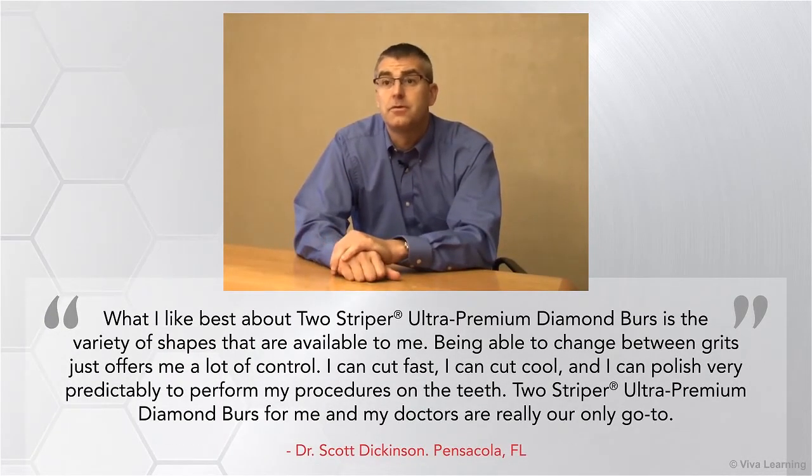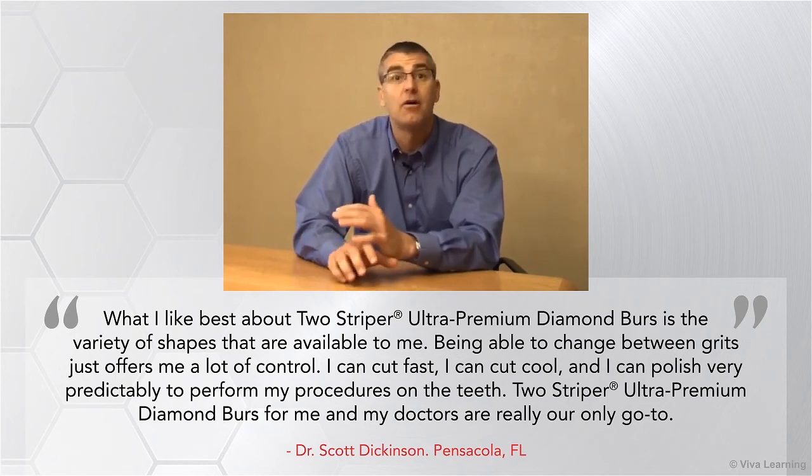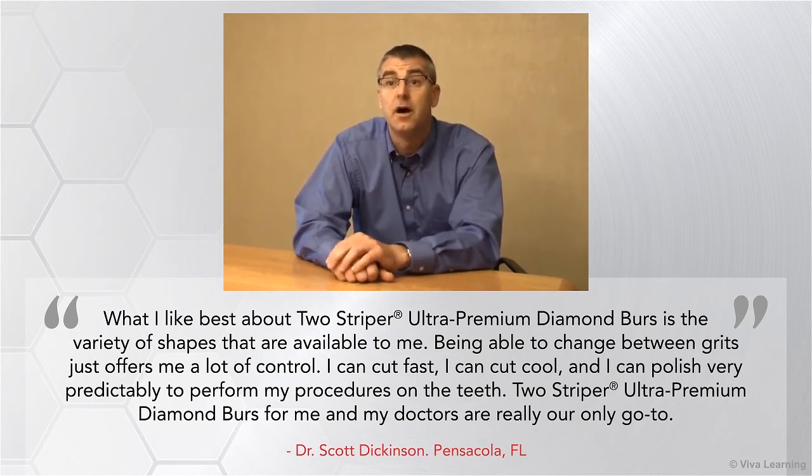What I like best about Two-Striper is the variety of shapes that are available to me. Being able to change between grits offers me a lot of control. I can cut fast, I can cut cool, and I can polish and very predictably perform my procedures on the teeth. Two-Striper for me and my doctors is really our only go-to.